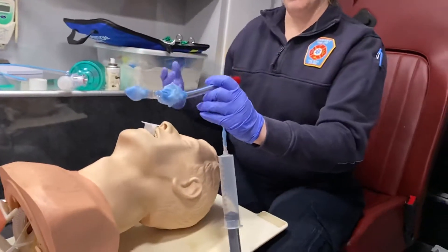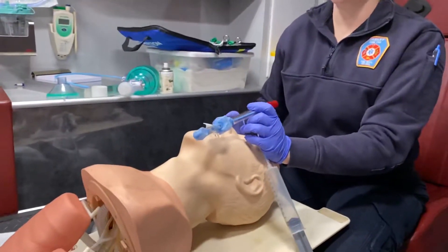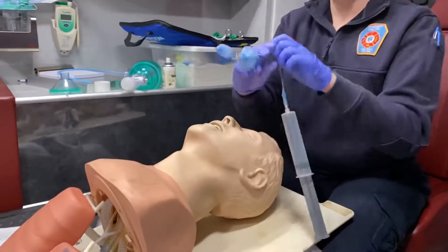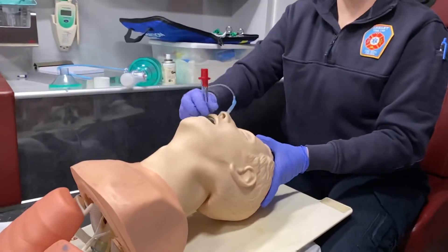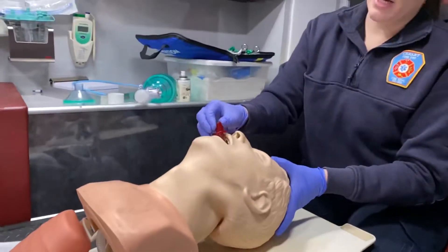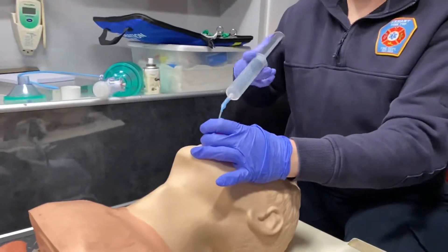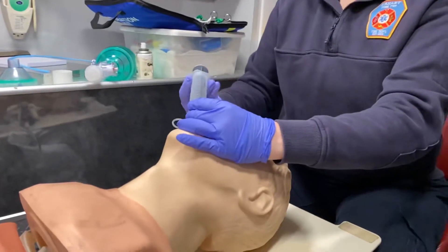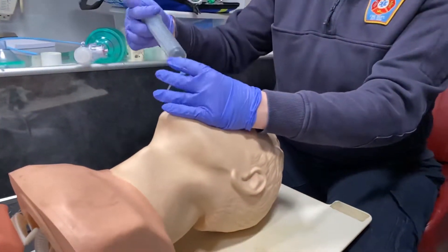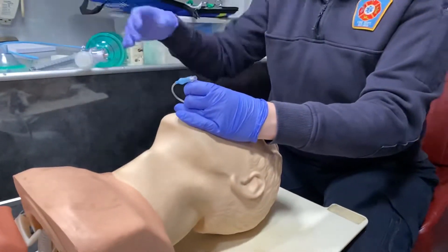When I'm ready, after my partner has pre-oxygenated the patient — meaning they've been ventilating with 100% oxygen — we can go ahead and take out the oral airway. This will also be a blind insertion. We want to insert the King Airway all the way down to the lip line. It will naturally seat in place. Fill the balloon, and once you fill the balloon, detach the syringe — otherwise the air will leak back into the syringe.